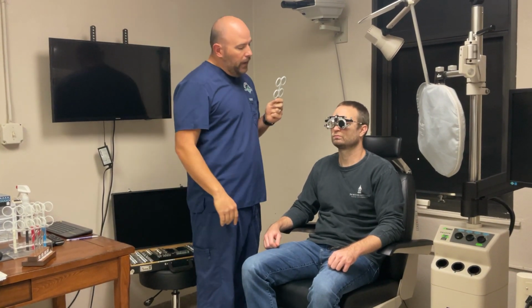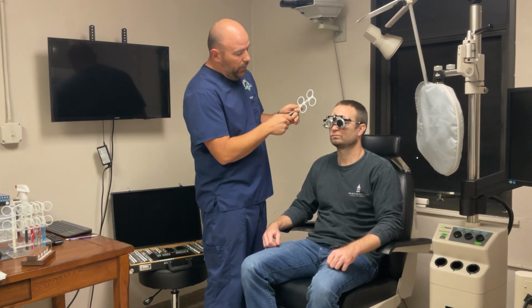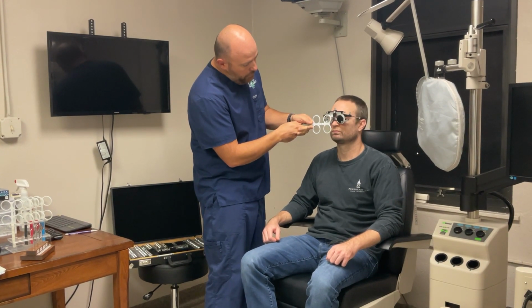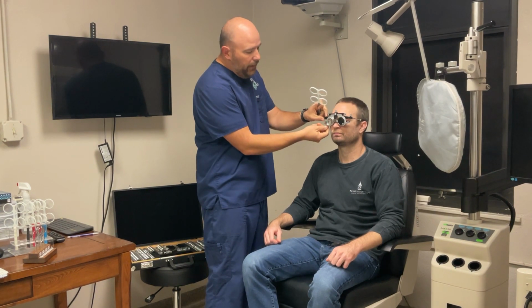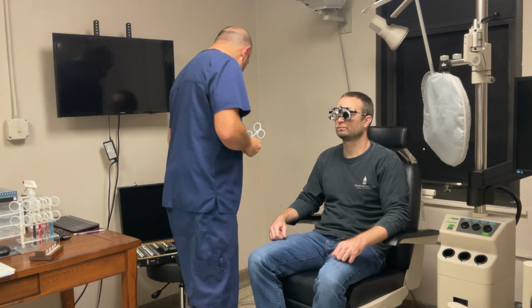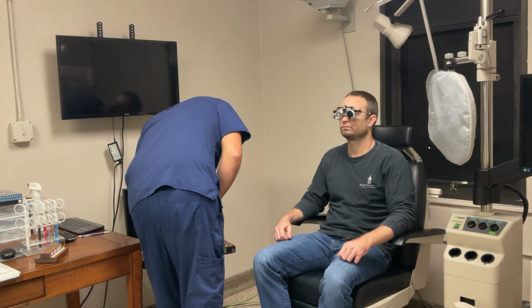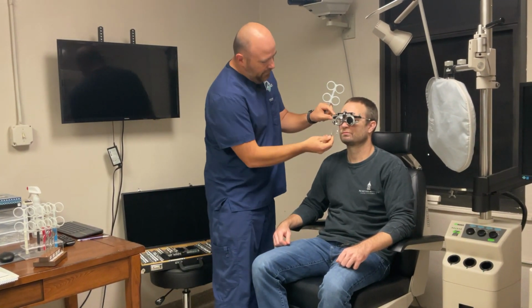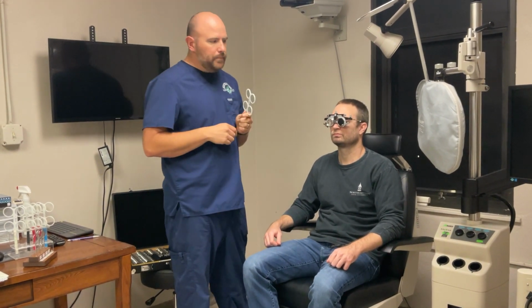Okay, same line, and I'm looking for clarity, okay? Not just darker or getting smaller, okay? Here is choice 1 and choice 2. 1. 1 is clear, okay. So now he's taking me back down to a 4.50. So he wanted the plus a half, so now I'm going to put the 4.50 back in front of him. All right, so 4.50 is back in front of him.